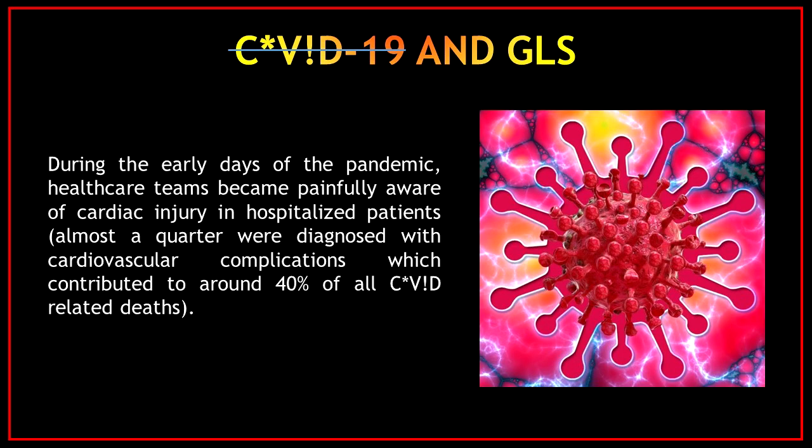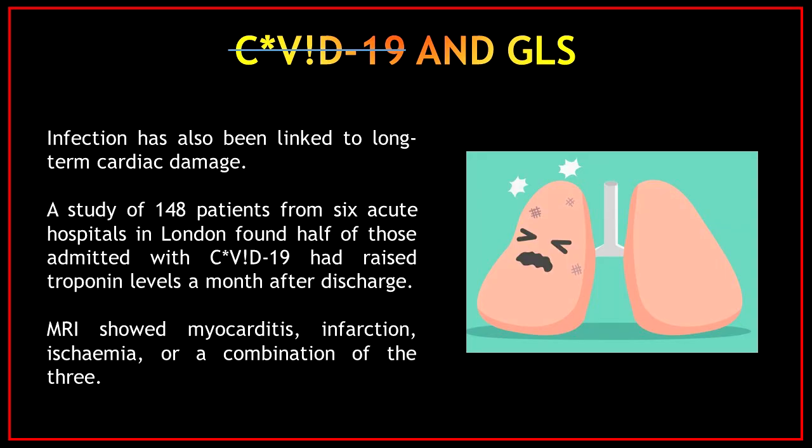Now let's talk about the uses of global longitudinal strain during the pandemic. During the early days of the pandemic, healthcare teams became painfully aware of cardiac injury in hospitalized patients. Almost a quarter were diagnosed with cardiovascular complications, which contributed to around 40% of all deaths related with this virus. Infection has also been linked to long-term cardiac damage.